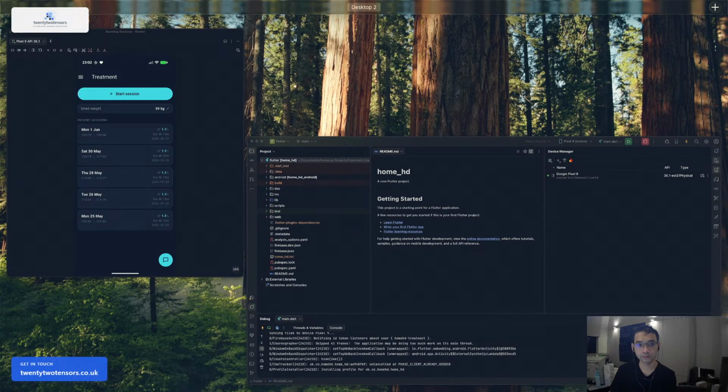In the current version, the AI can only answer a few questions, like what is my next delivery, and I want it to be able to use and perform actions on the app through the API.